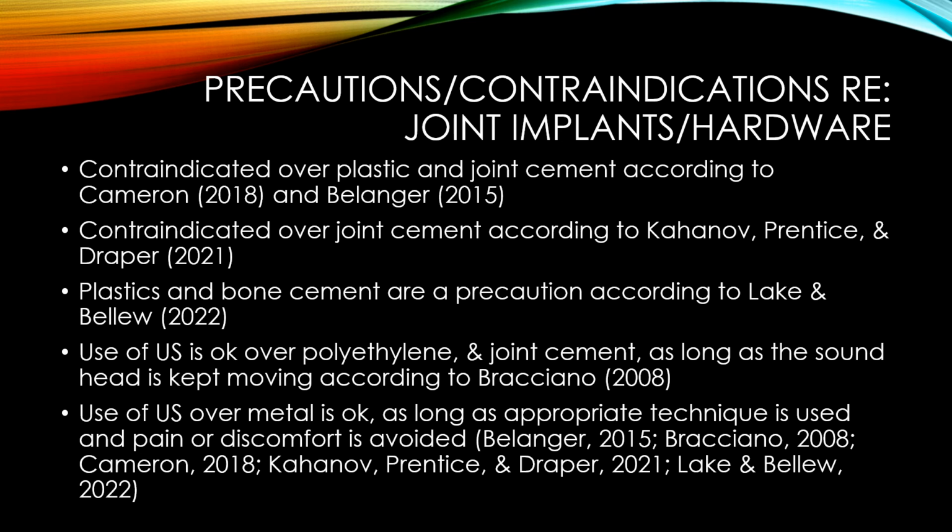Interestingly, ultrasound over any metal hardware is fine as long as you use appropriate technique and pain or discomfort is avoided, like you always would. So all 5 of the textbooks say that it's fine to use ultrasound over metal plates, screws, that sort of thing.